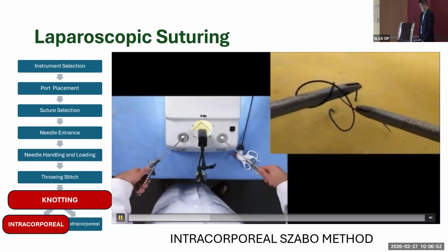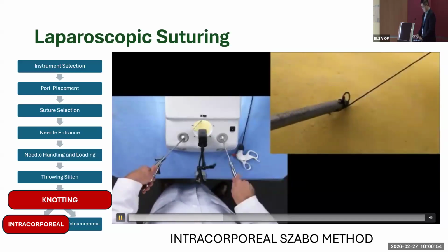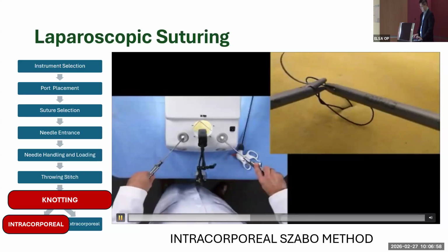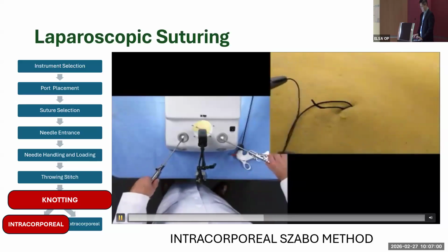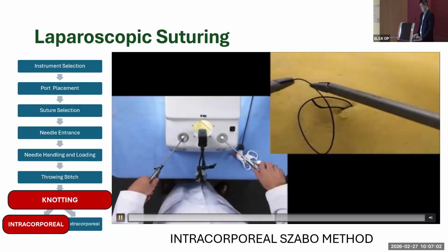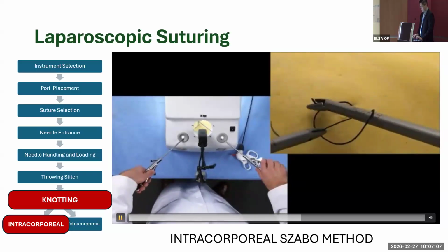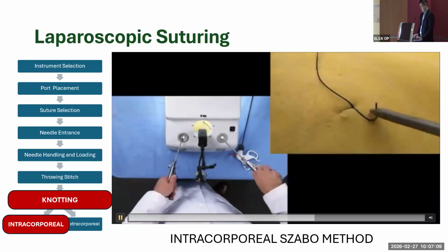Do it once more. Grasp the tag and pull it tight. We now change. The left hand grasps the suture. The needle is to the left of the left-hand needle driver. The right hand is on top of the suture. We rotate externally, and the needle driver goes over the left-hand needle driver, and we pull that down.